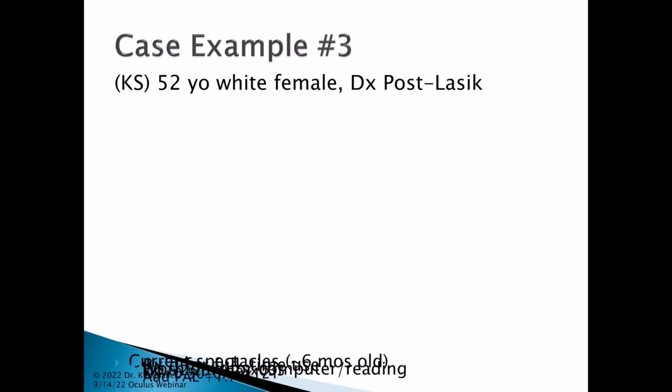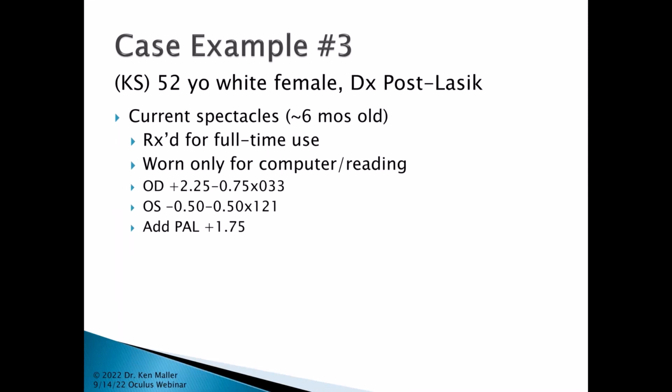So she came in to see me, and she was wearing glasses. However, although they were Rx for full time, she only wore them to help her at the computer and for reading. She does a fair amount of computer work. You can see the powers there. There's very little for distance in the left eye, which is why she probably walks around uncorrected.